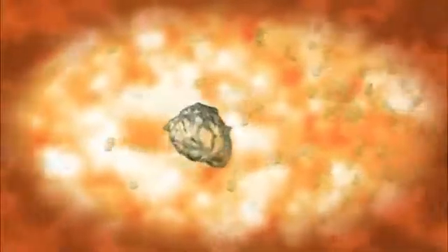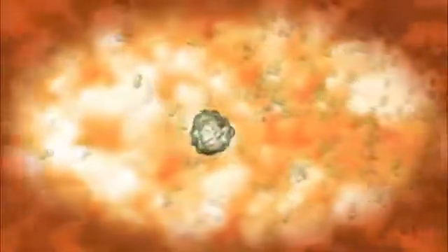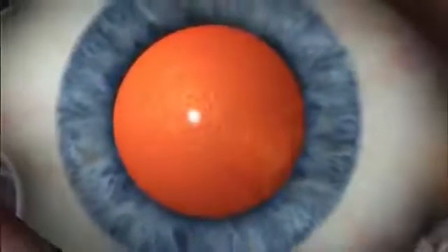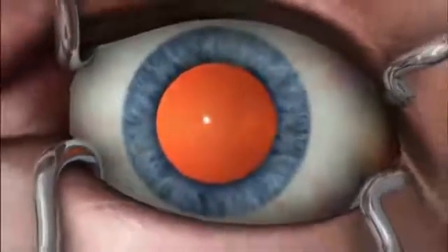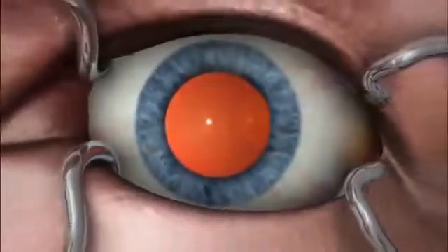As we age, these proteins change and may begin to clump together, obscuring portions of the lens. To correct this, a doctor may recommend phacoemulsification cataract surgery.